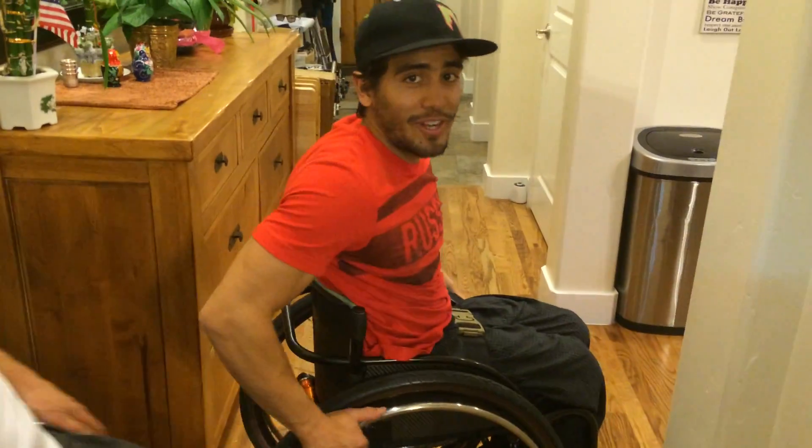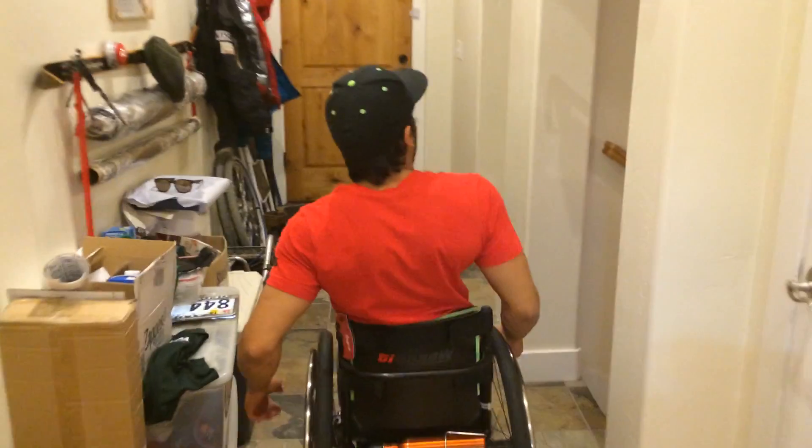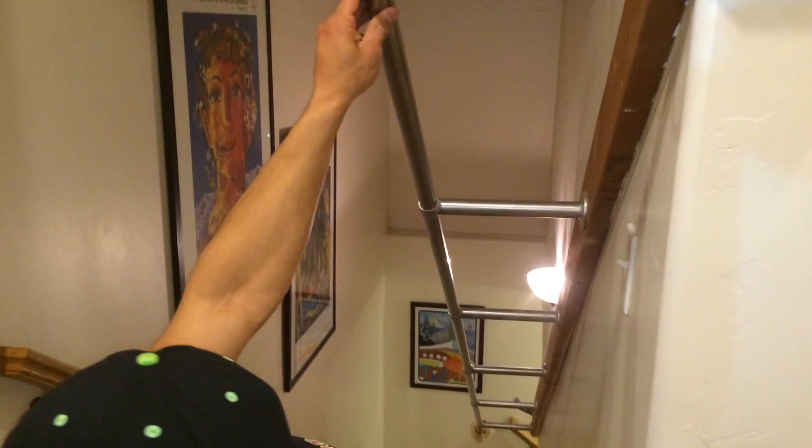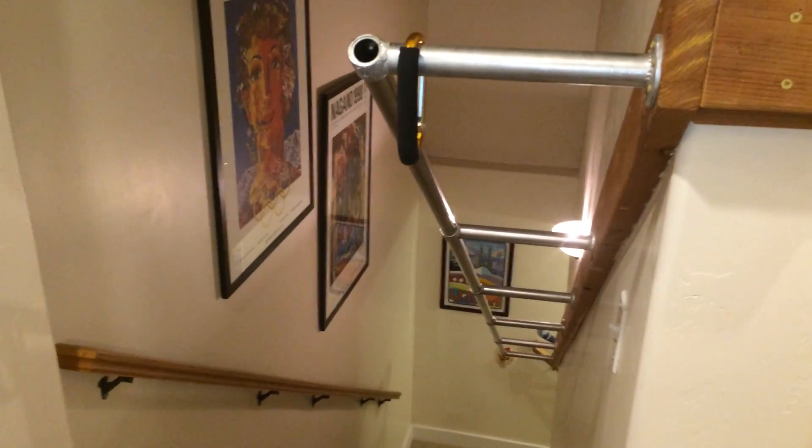Let's demonstrate how it works. Normally how we go up and down the stairs is with another invention of Eric's, which is the hang rail. With just a belt you attach the wheelchair to yourself and then you can easily go down and up the stairs.